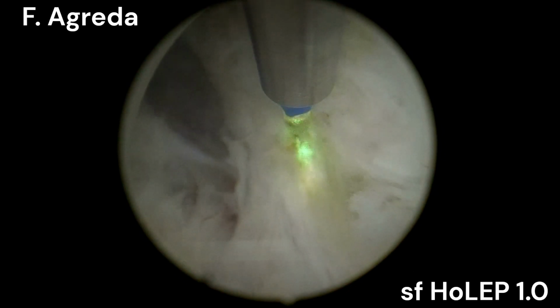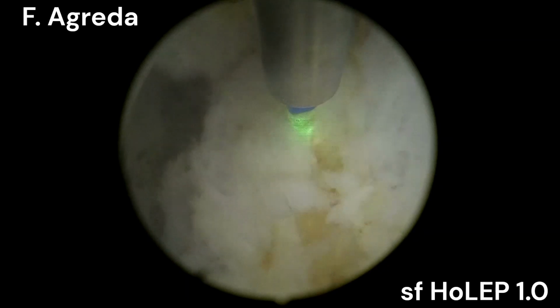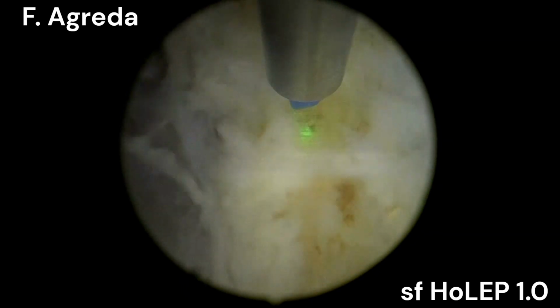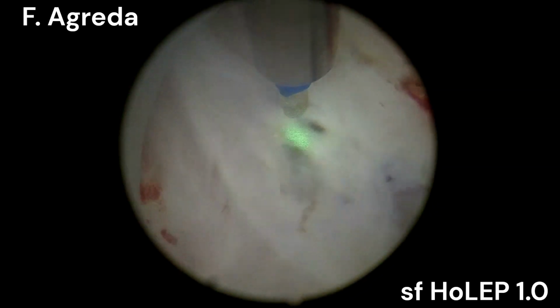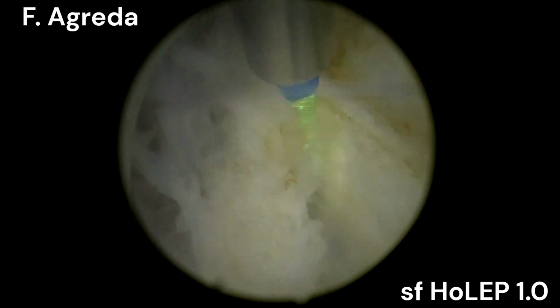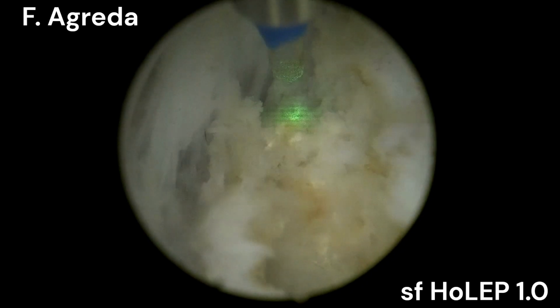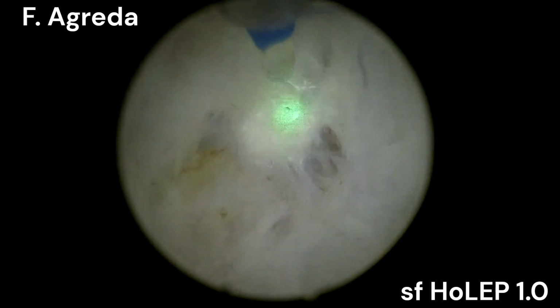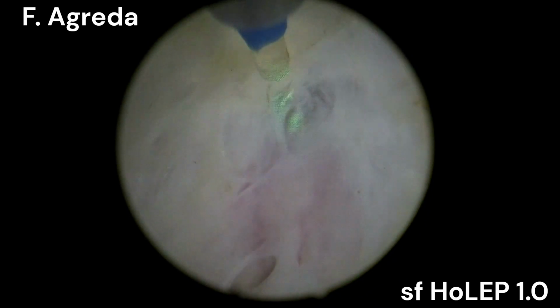As we can see here, I'm trying to make a change of plane in this right lobe, because I'm guessing the left plane, as you can see here on your screen, is kind of too deep. The capsula is getting too thin, so I'm going to keep a little bit more of capsule. So I'm going closer to the adenoma here. It's kind of attached, as I said before, kind of sticky, more on this right side than in the left side. And you can see here the capsule is very, very thin, almost going too thin to the capsule. So probably I have to go a little bit more close to the adenoma to avoid any kind of perforation.